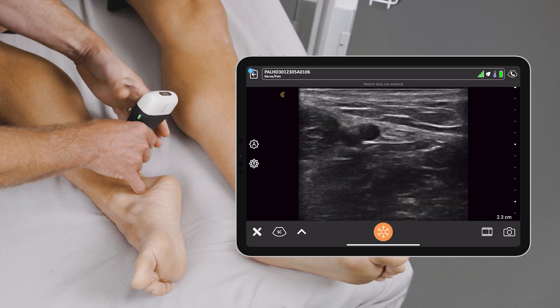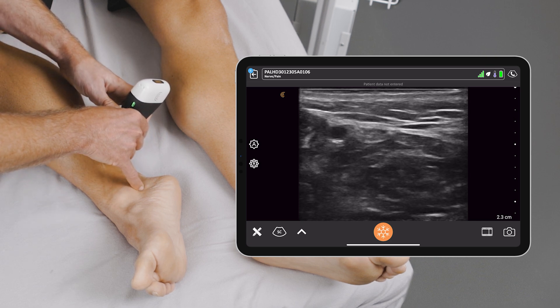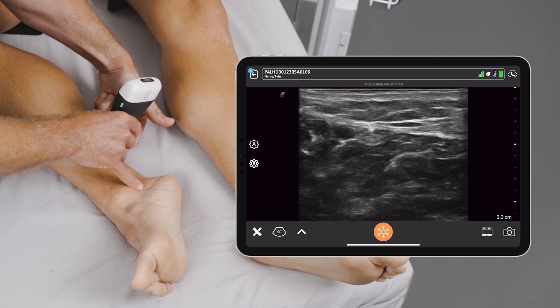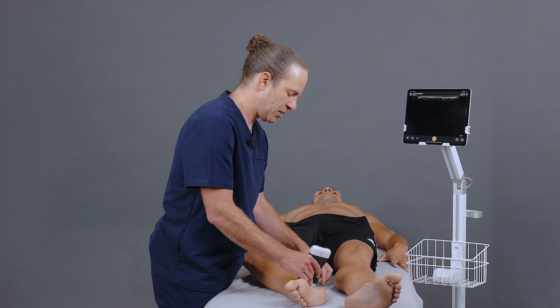I could either do the block here, or I like to track that nerve just slightly more proximal to get me a bit more purchase above the Achilles tendon and allow me to insert my needle from the posterior aspect, coming in along the screen and being able to bathe that nerve with anesthesia.